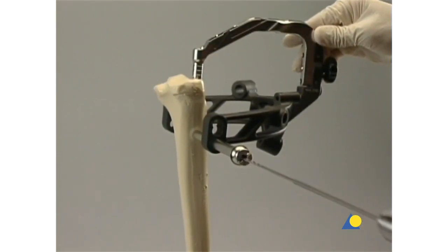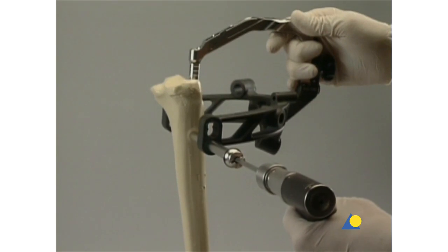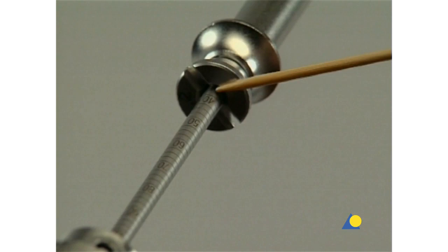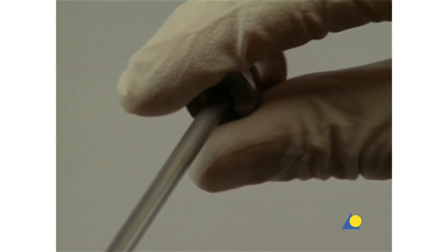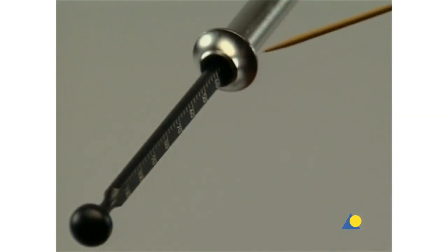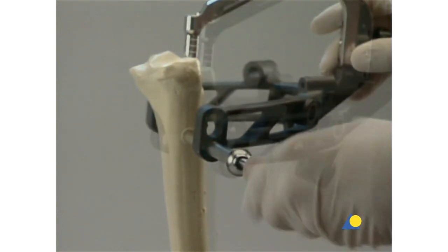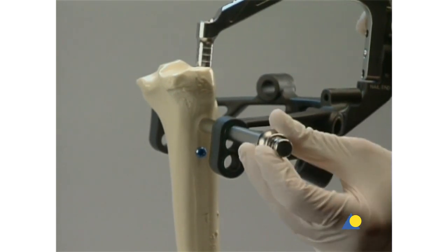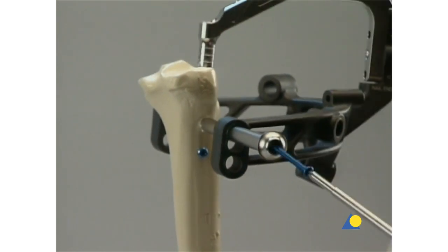Using the corresponding drill bit, both cortices are drilled until the tip of the drill bit just breaks through the far cortex. The drill sleeve is pressed firmly against the near cortex, and the measurement is read from the calibrated drill bit, corresponding to the appropriate length of the locking screw. The drill bit and drill sleeve are removed. As an alternative, the length of the screw can be read from the depth gauge for locking screws, measuring from the shaft of the depth gauge. A locking screw is inserted with the star drive screwdriver through the protection sleeve until the head lies against the near cortex. The tip should not project more than two millimeters beyond the far cortex. These steps are repeated for the second locking screw.